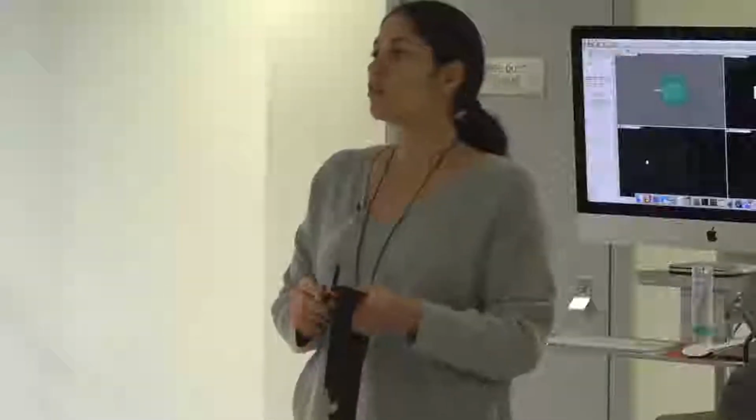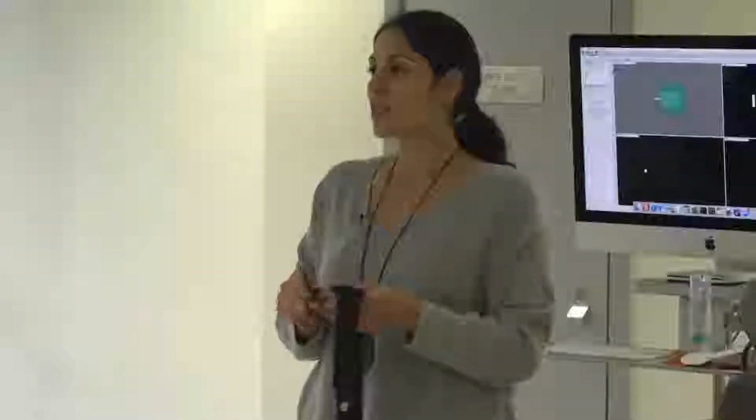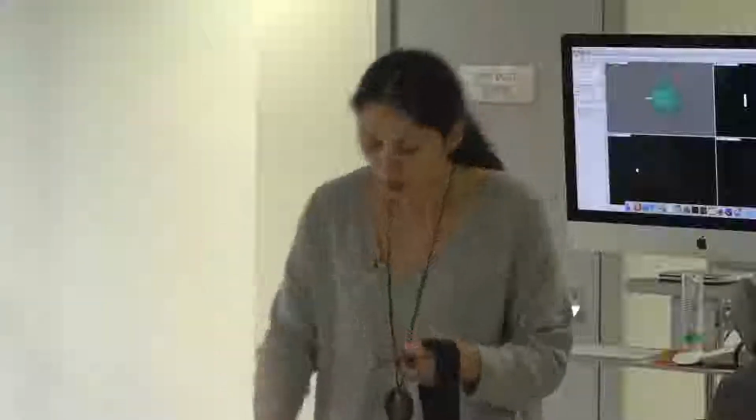This procedure, you will have to do every time you are going to do your TMS experiment with this fancy equipment. Probably you will be doing motor area stimulation.